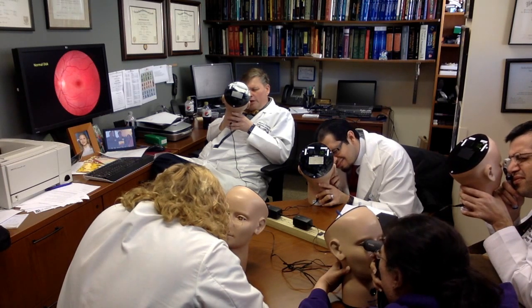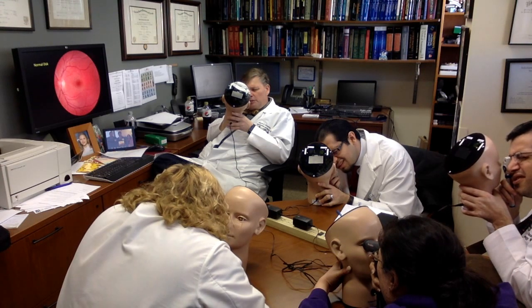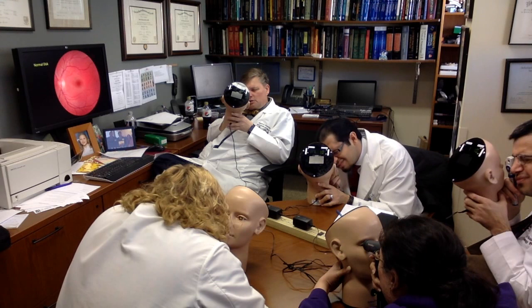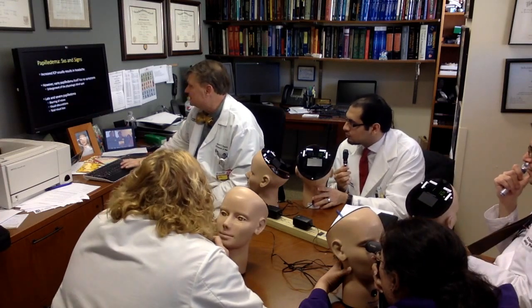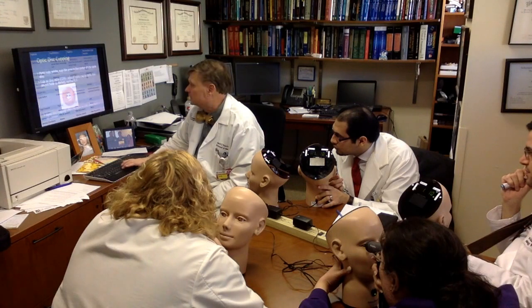And does everyone now see the disc? Yes. Okay. What do you think about the cup size compared to the disc? Huge. Very big. It's much bigger. So the cup to disc ratio is increased. Does everyone agree? Yes. Okay, good. Do you know what finding that is classically seen in? Glaucoma. Exactly.